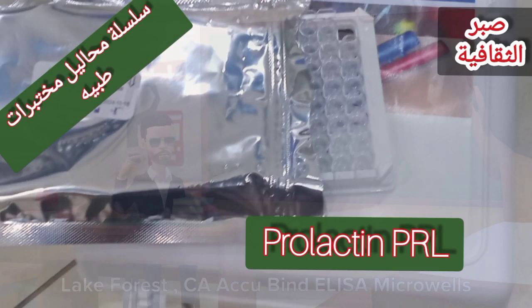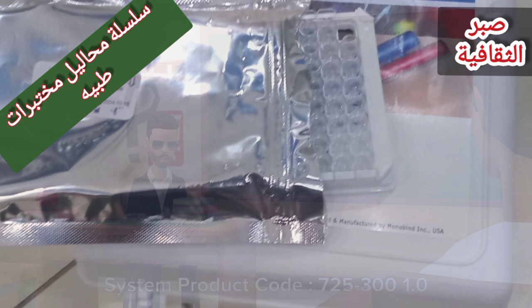Lake Forest, California. AccuBind ELISA Microwells, Prolactin Hormone (PRL) Test System, Product Code 725-300. 1.0 Introduction. Intended Use: The quantitative determination of prolactin hormone concentration in human serum by a microplate enzyme immunoassay, colorimetric. Summary and explanation of the test.